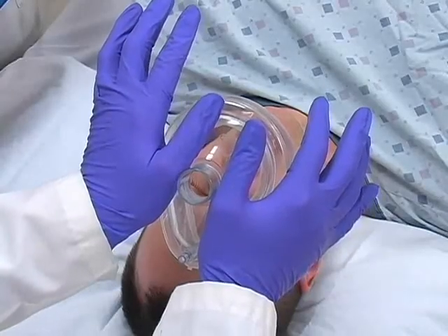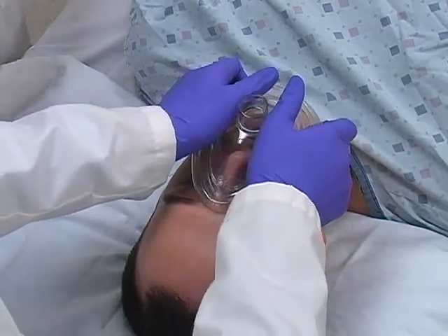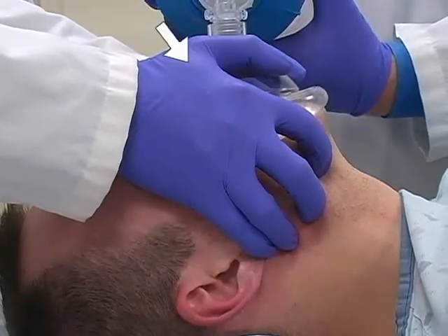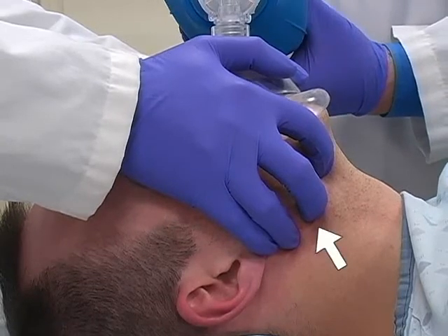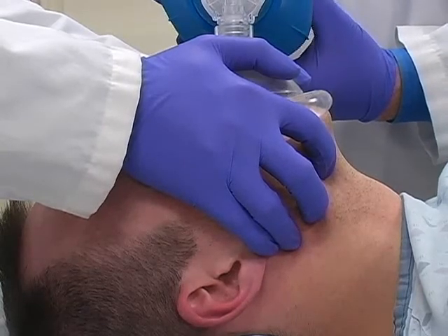The first provider holds his thenar eminences parallel to each other along the lateral edges of the mask. The mask is then lowered onto the face, and the fingers are placed along the underside of the mandible. Pressure is applied to the mask with the thenar eminences, while the fingers pull the mandible upwards. Chin lift and jaw thrust may be applied concurrently.